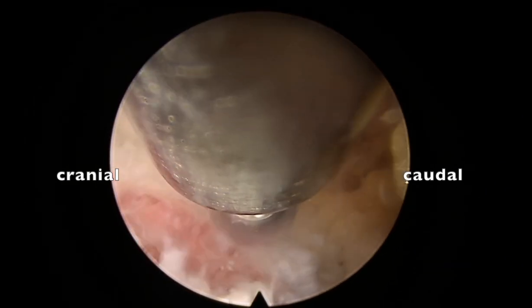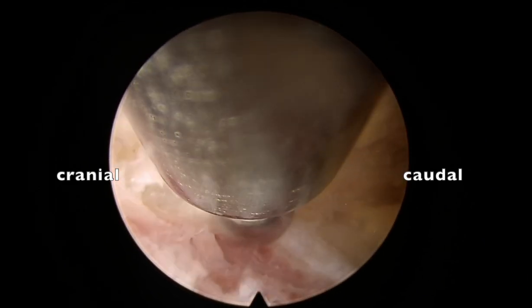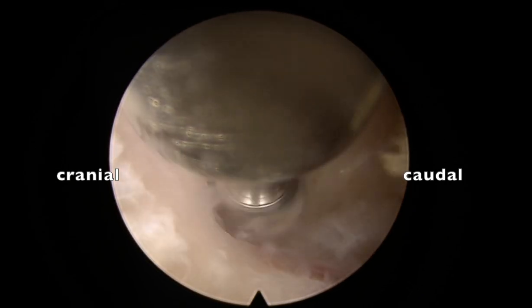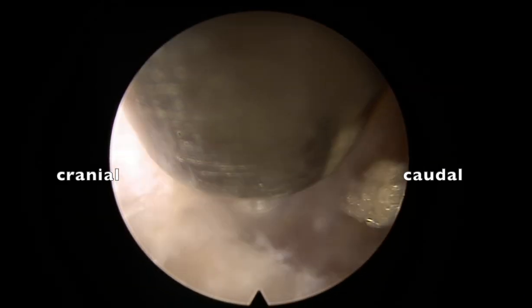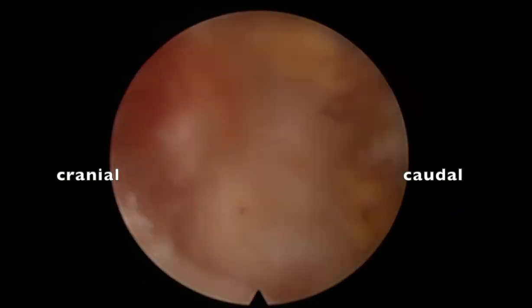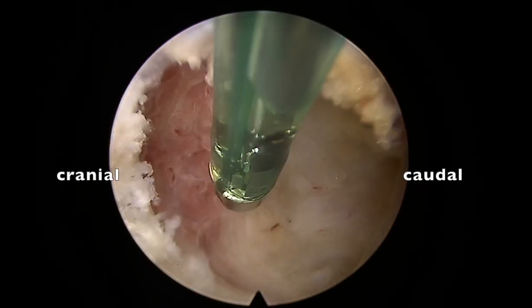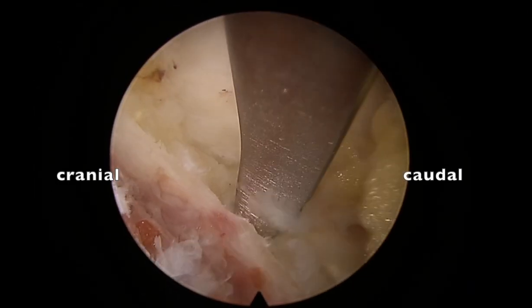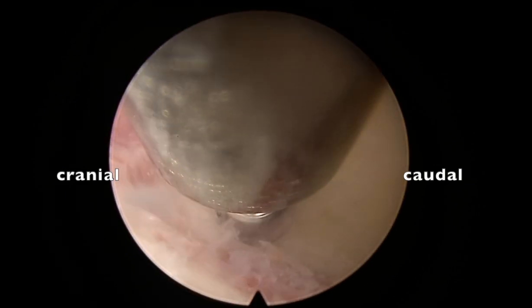Bit by bit it should be removed and drilled nicely. Always remove the soft tissue when drilling. Once drilled, the soft tissue is coagulated with RF so that you have very good, clear visualization of the edges. Use RF to shrink the edges of the tissue. Always delineate the edges — the edge of the facet, facet-laminar junction, and the inferior border of the inferior facet.